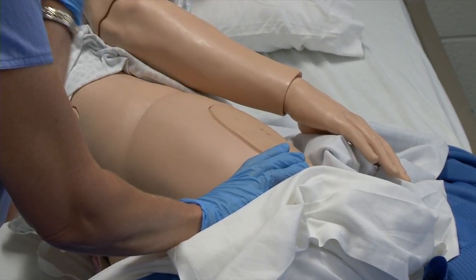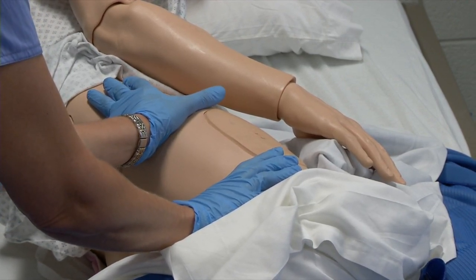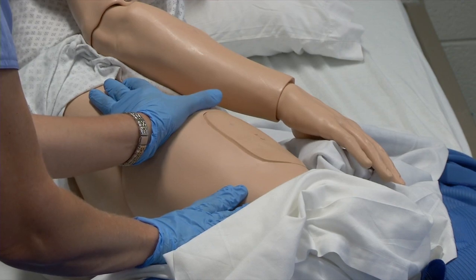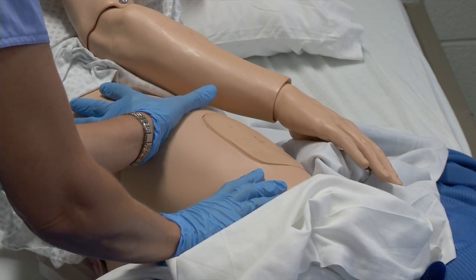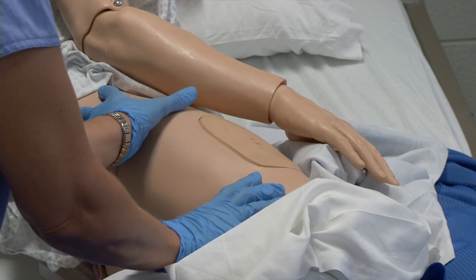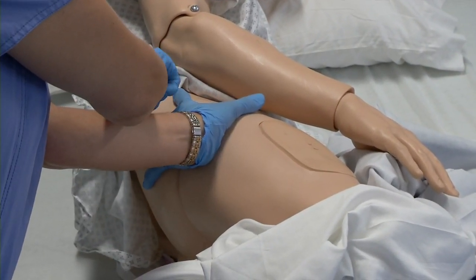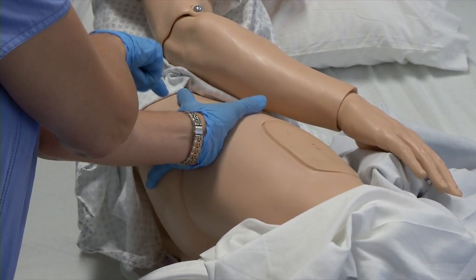Place the palm of your hand over the greater trochanter of the patient's hip with the wrist perpendicular to the femur. Use the right hand for the left hip and the left hand for the right hip. Point the thumb toward the patient's groin and the index finger toward the anterior superior iliac spine. Extend the middle finger back along the iliac crest toward the buttocks. The index finger, the middle finger, and the iliac crest form a V-shaped triangle. The injection site is in the center of this triangle.